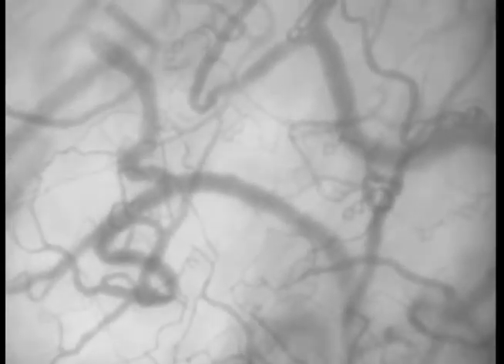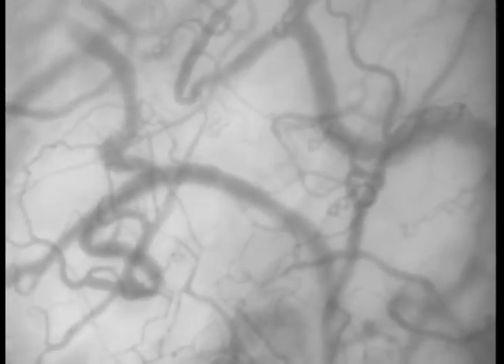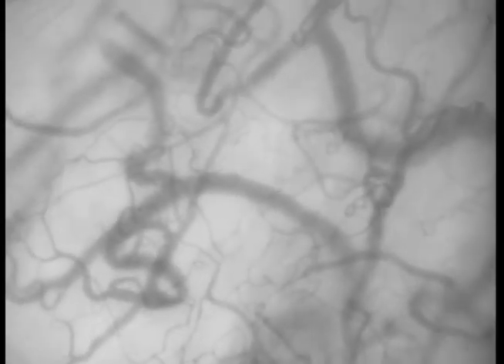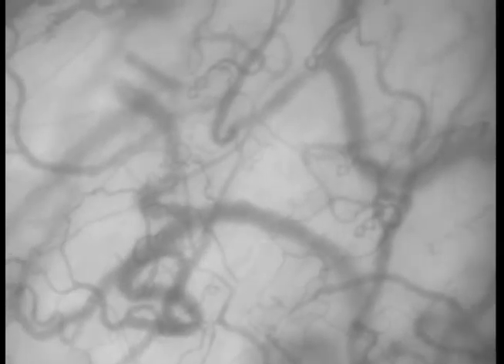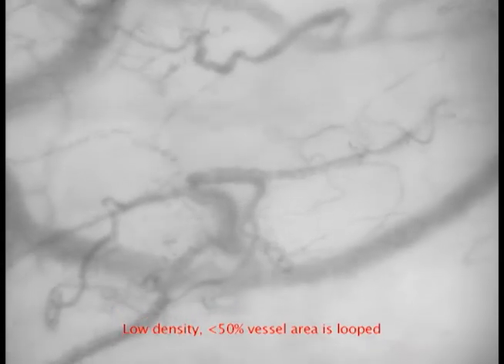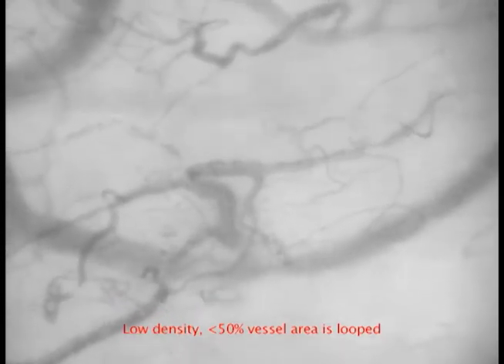Here you'll notice that there's more vessel surface area that is looped upon itself than in the previous set of videos. These loops present a problem when we're doing analysis because they're very hard to trace out and they can represent a false sense of flow. You'll notice that some areas of the vessels are bundled upon themselves or very tortuous. These are what we consider loop vessels.